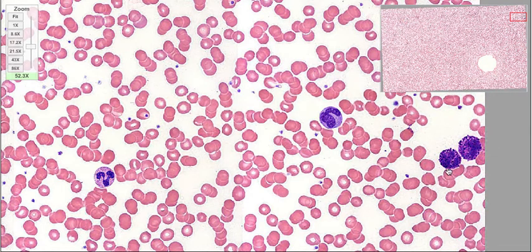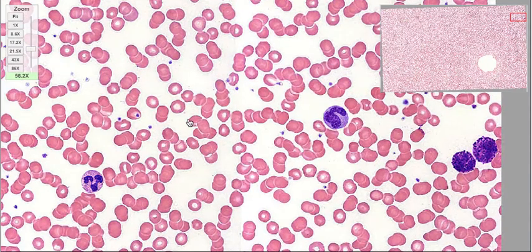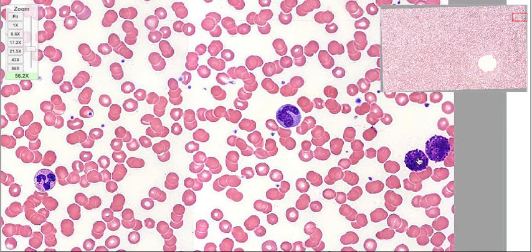And when you look at a basophil, the granules are so big and so numerous that they typically overshadow the nucleus that is underlying the granules within this cell. They're the last member of the polymorphonuclear family. I'll try to zoom in a little bit more on this stain, but they will have more than one component to the nucleus. So there's an outline here and an outline here and another one over here.